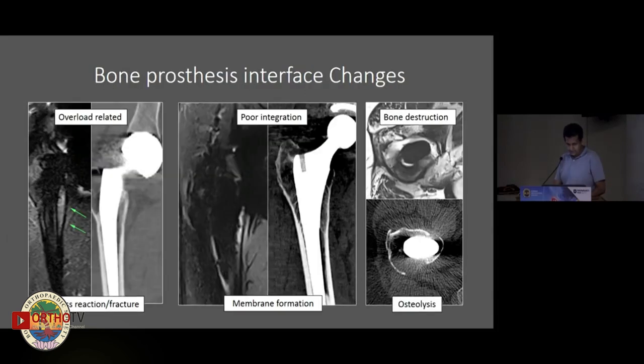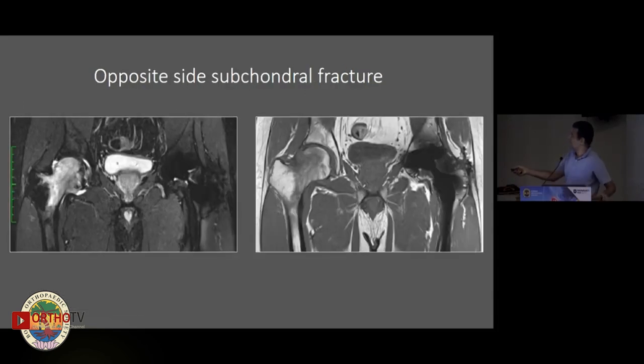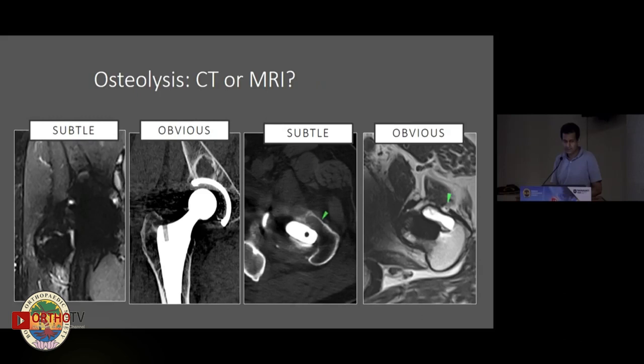One of the other things we see on MR that's hard to pick up on CT is that you get a free look at the other hip. Here, somebody presented with a painful hip but has actually developed a subchondral insufficiency fracture in the opposite femoral head — something you can pick up on MR really nicely.